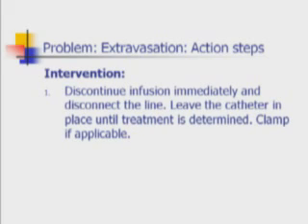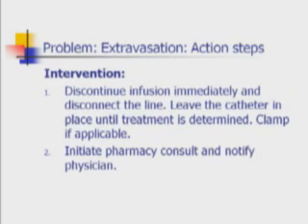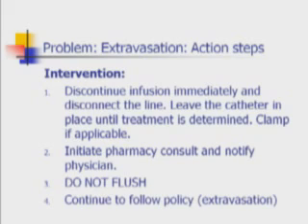Discontinue infusion immediately and disconnect the line. Leave the catheter in place until treatment is determined. Clamp, if applicable. Initiate pharmacy consult and notify physician. Do not flush. Continue to follow the extravasation policy.